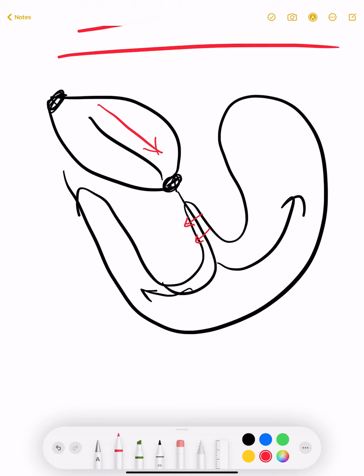And then, as I told you, both ventricles will be depolarized at the same time, and the direction of depolarization will be from inside to outside. So ultimately these are the vectors, or the current flows, which we will have during depolarization or repolarization, but I will be discussing only depolarization.